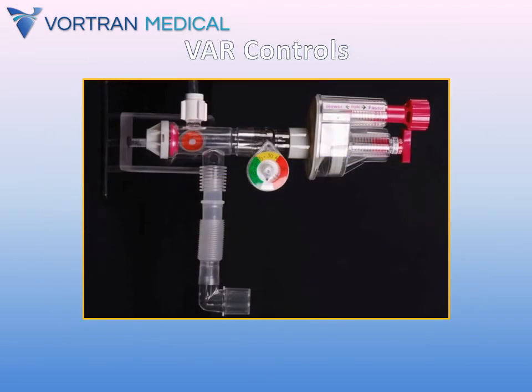Okay, now bearing all this in mind, how do we operate the ventilator, and specifically our brand, the VAR? First thing is to realize there are 3 safety mechanisms designed into the VAR that we don't find in a bag valve mask. The first is the pop-off valve that we showed you earlier. The second is built into the VAR's design and prevents an incomplete exhalation, or stacking breaths, which often happens when we excitedly bag a patient too fast.